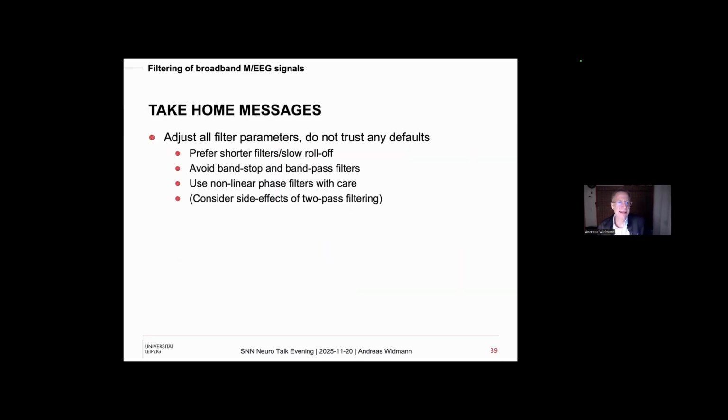Everything else is basically the same. So the take-home message of the second part: intentionally adjust all your 5 filter parameters. Think about each of them and adjust them to your application and to your needs. Do not trust any defaults. Think about it and set them manually.